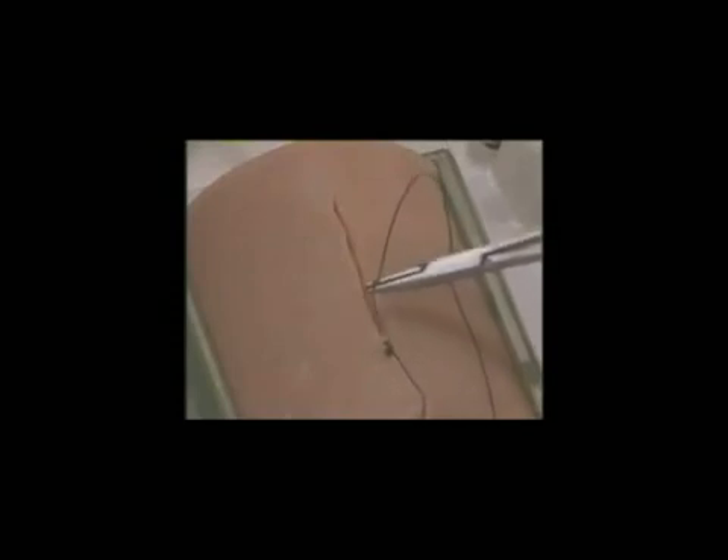Cut your suture loop leaving your needle attached — this is cut on the knot. Reload your needle and bring the needle behind your knot, sinking it between the two layers of tissue, trying not to grab either side. Sink between the tissue, come underneath your knot and up through the skin away from the incision. When this is drawn through, it rotates the knot underneath and buries it. The suture is then cut and the tail disappears.